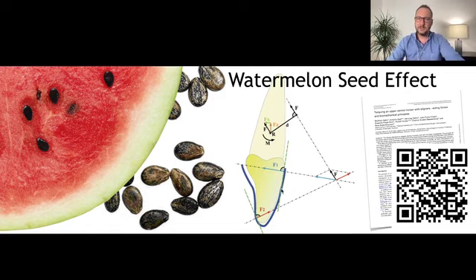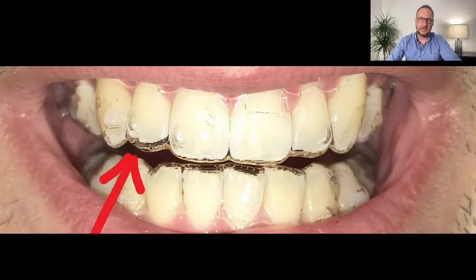But if you want, for example, to avoid intrusion, or if you want to extrude, placing an attachment in this area is very important. Otherwise, this is something that usually happens. You start seeing the aligner in one position and a space between the aligner and tooth, like you can see here. Why is this happening? Because you can see here we have an attachment. We can see clearly by the shape of the plastic, but even when we place attachments, depending on the size, and this is a very small size, in this case this effect happens.